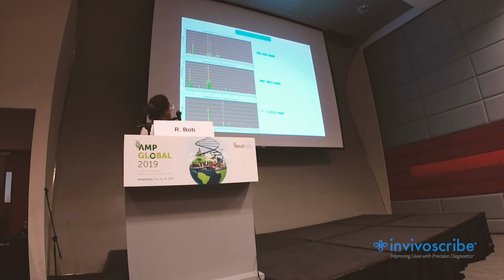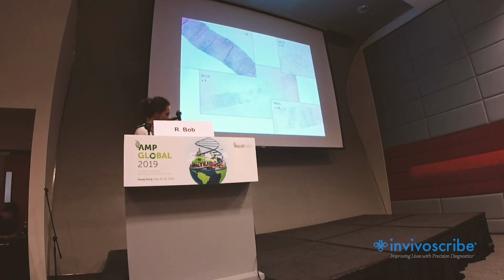And for framework 3, there is one sequence which is dominant. We can see also the same VHJ segment combination as for framework 2. It could be otherwise good enough, but still the number of reads is not enough. Now we want to see what's the reason for such a result. That's the sample that we got from the clinician. It's a needle biopsy. You see a lot of collagen bundles, which are PCR inhibitors.